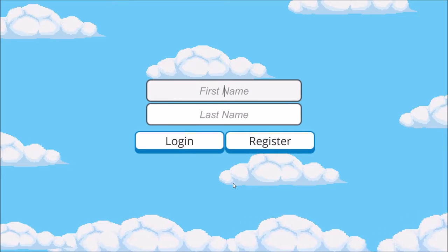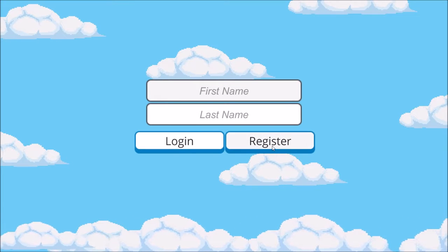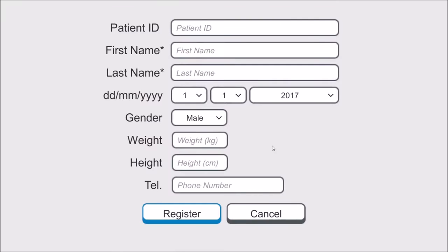This is the login scene. If you are a new user, you can click on the register button. Type the information in the input field and then click the register button.